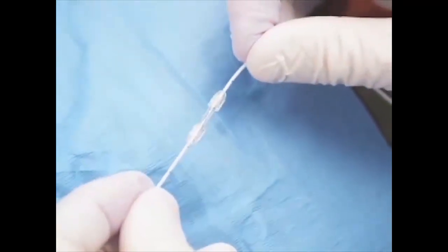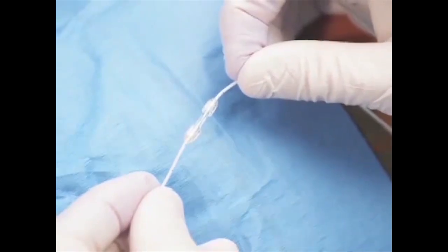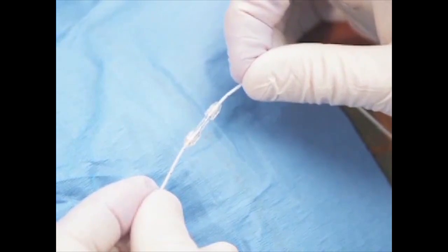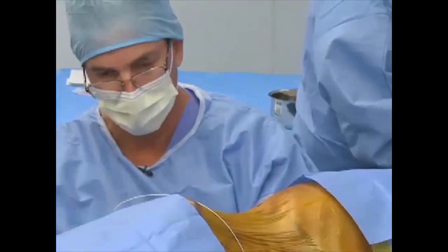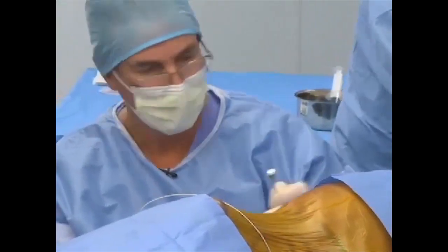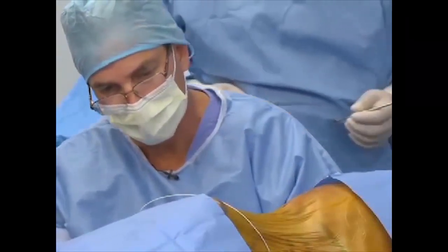Double-check the catheter segments to ensure they are securely connected by pulling the two collets in opposite directions at the same time. The collet should not move back and forth or rotate and should feel firmly attached. Also, gently pull on the catheter segments at the same time. The catheter segment should not detach. Verify catheter patency by observing CSF backflow at the pump pocket site.